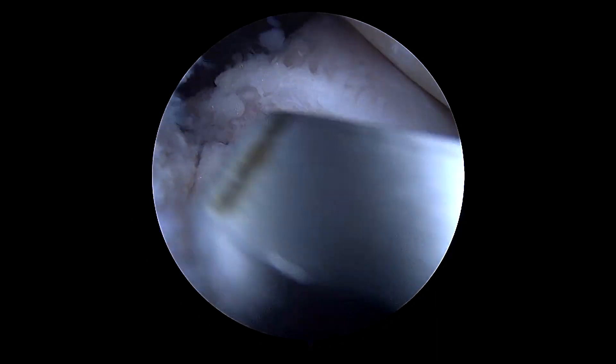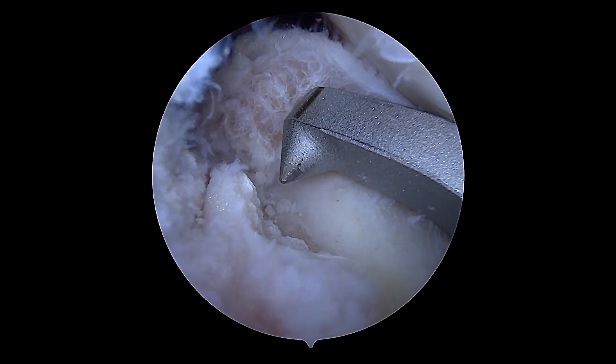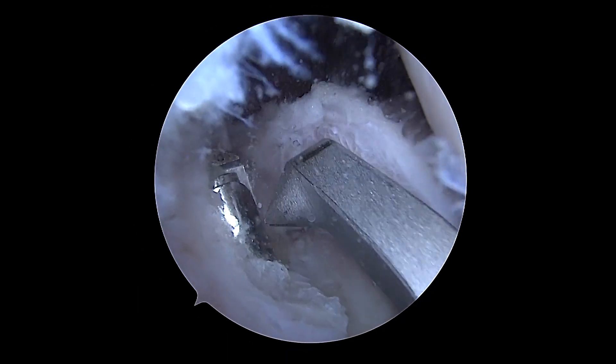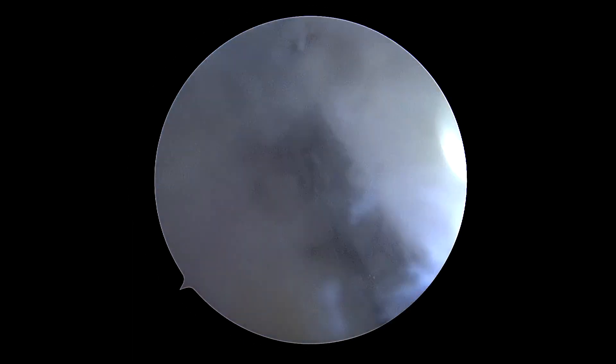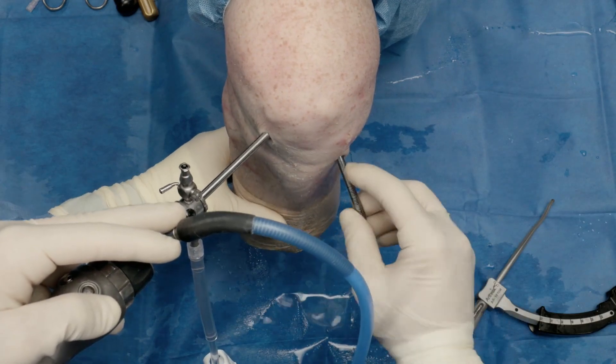Once we're confident we've hit our target, we can remove the guide and decorticate to make our socket and create some biology. You can already see even in this cadaveric specimen the osseous elements coming through. We slowly introduce the flip cutter — it really hits our target well and we have great visualization back here. Under direct visualization we open that up and go about five or so millimeters in to really decorticate that bone and create some nice biology. Then we flip it and come back out.